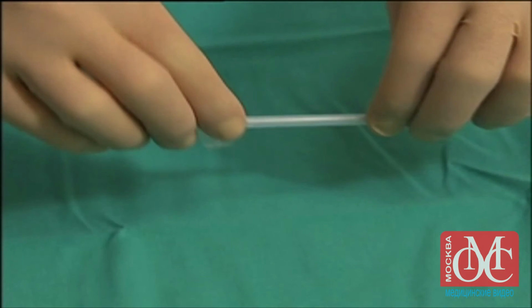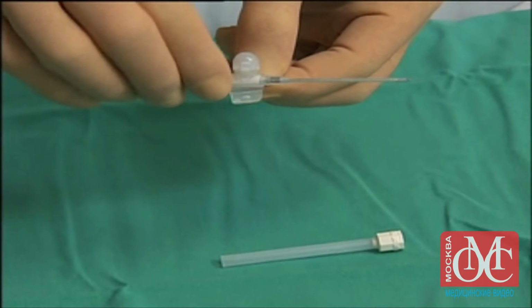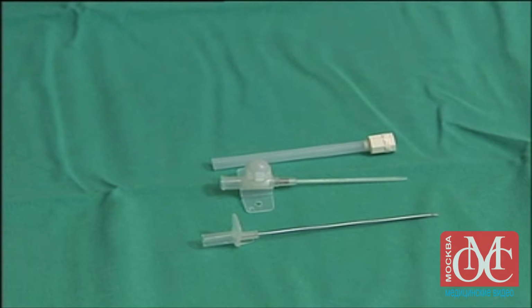Numerous devices can be used to perform needle aspiration. You should be familiar with the specific devices available at your institution. In this video, we will use an intravenous over-the-needle catheter to demonstrate the procedure.